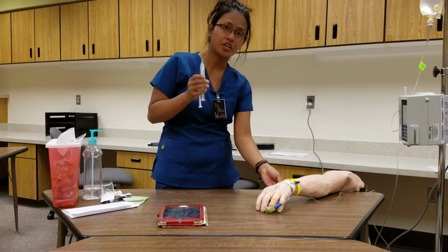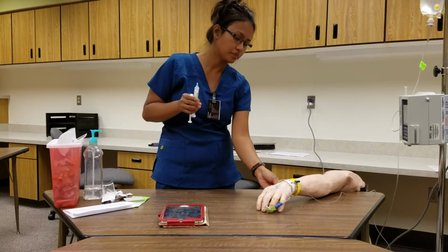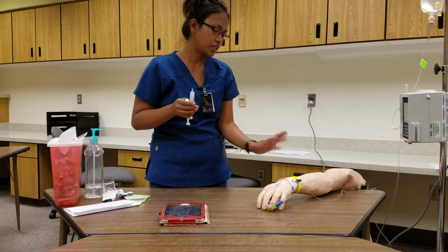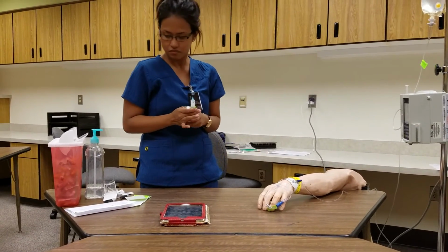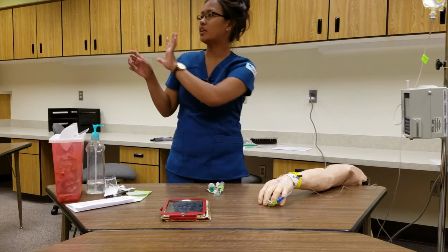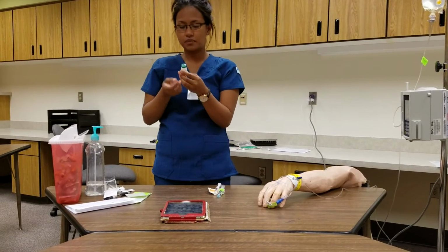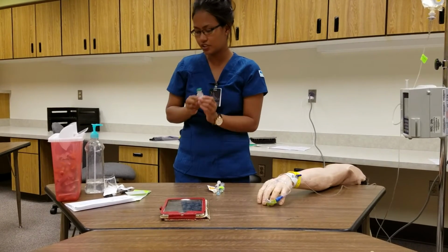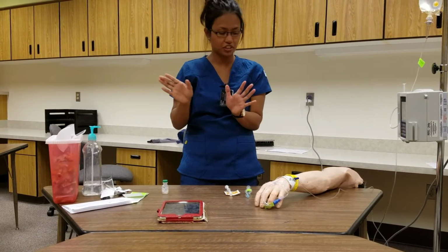Actually, before doing that, I should have checked my patient's identification first. Miss Jones, can you tell me your full name and date of birth? So I determine that, and I determine her allergies. If I have a scanner, I will be scanning her name and looking at the MAR. If it's the same, it matches. I am again double checking my MAR, and I'm scanning my medication again. I want to make sure it's all compatible and it all matches.